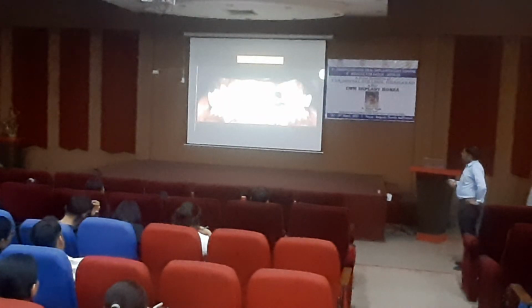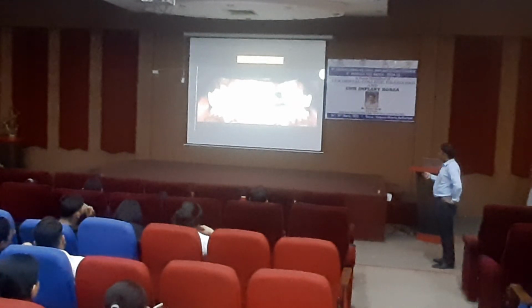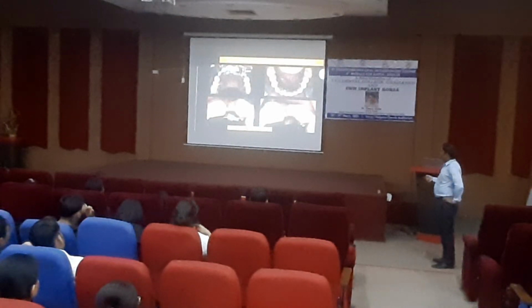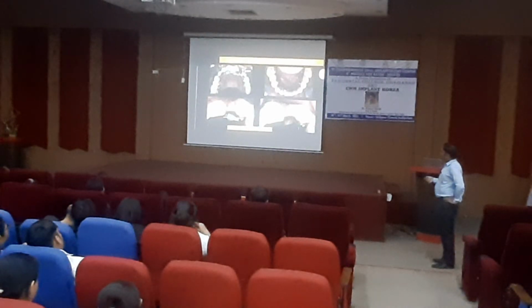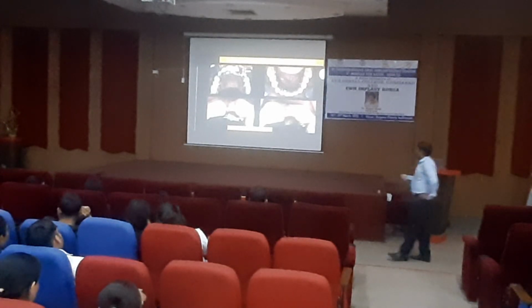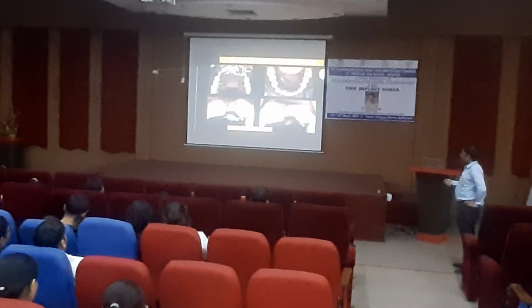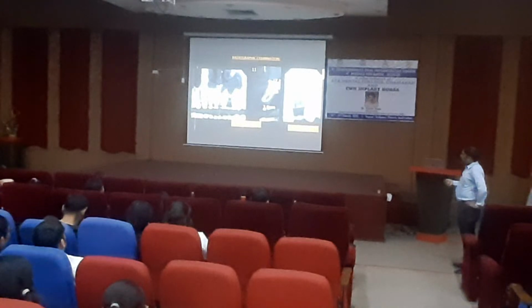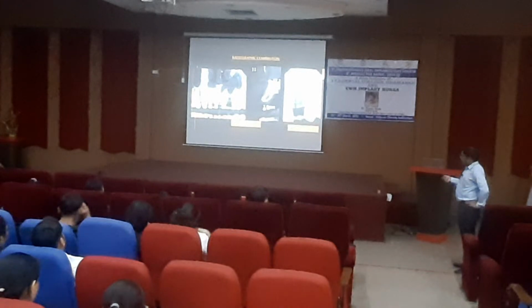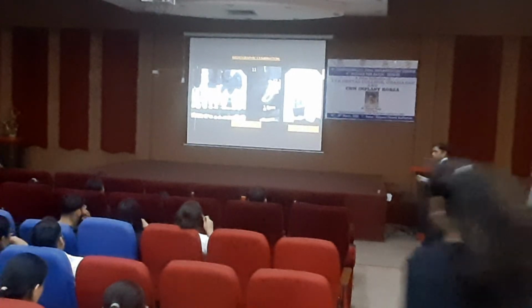This is the ridge split. If you see here, there is a concavity on the second quadrant, lateral side. It is almost around 3 mm. It is a case of lingual orthodontics. So we create a space between the lateral incisor and the canine. This is the CBCT. There is 3 mm of bone, but the vertical height is good. If you see here, there is 17 mm of vertical height. Then, after the ortho treatment, we get a good amount of mesiodistal width.